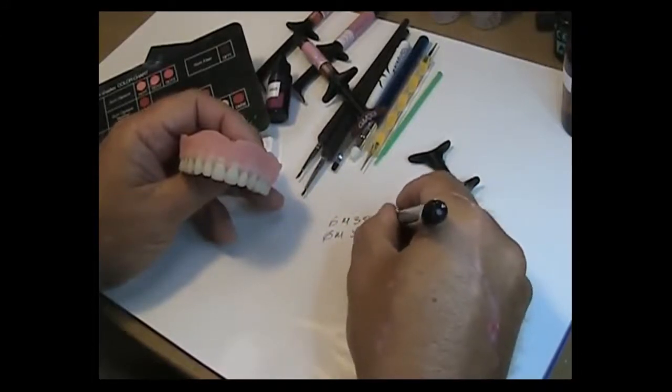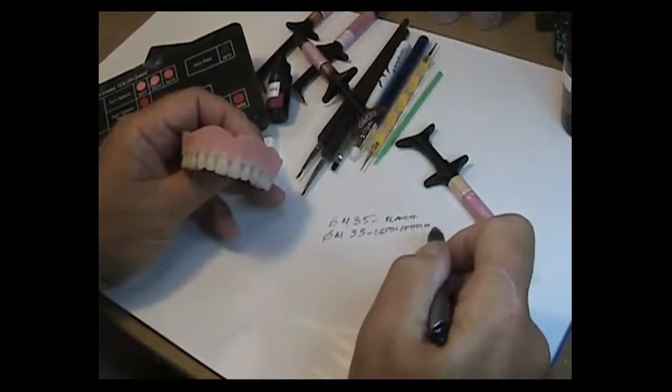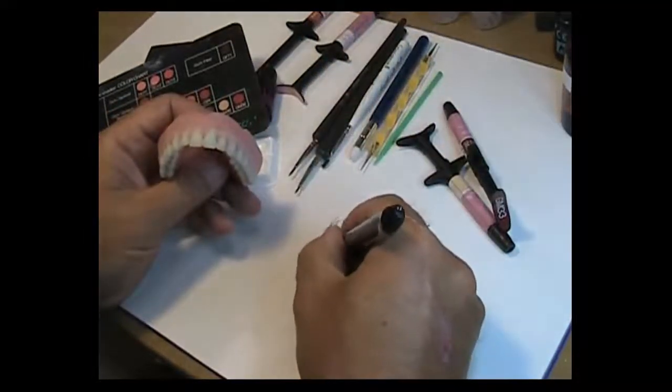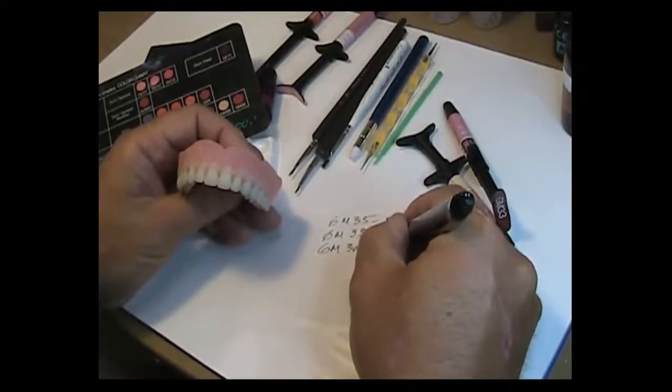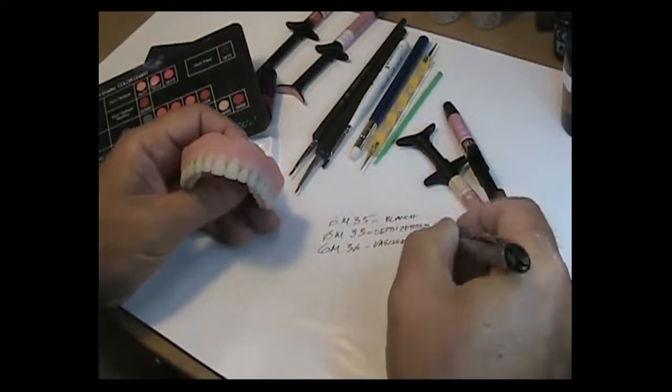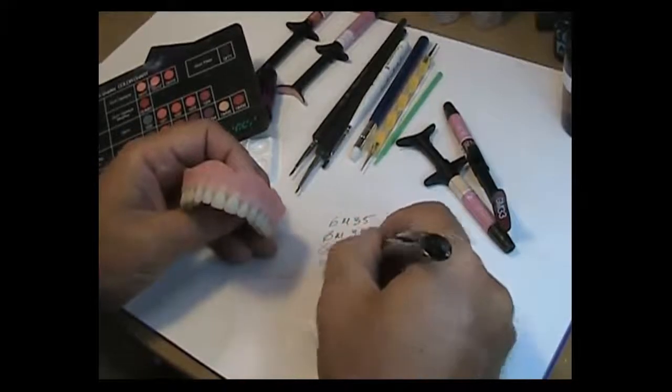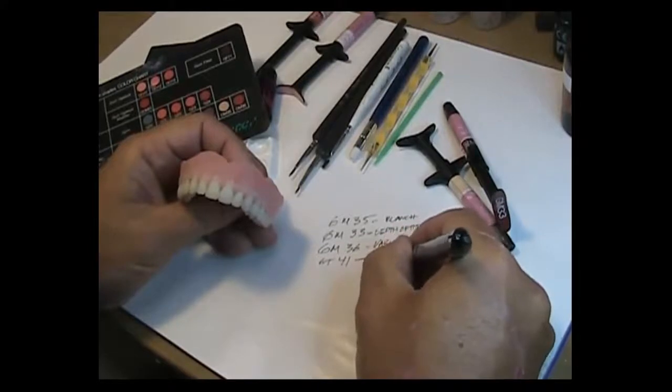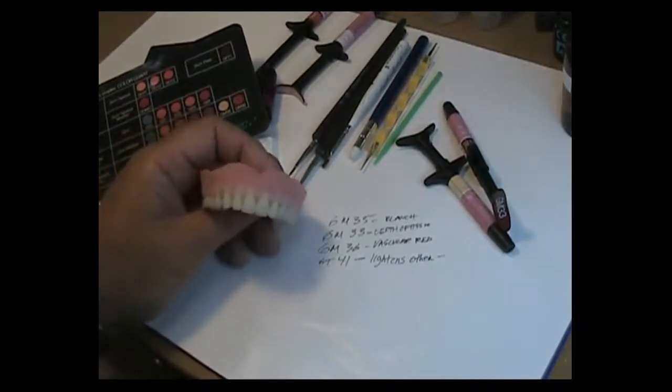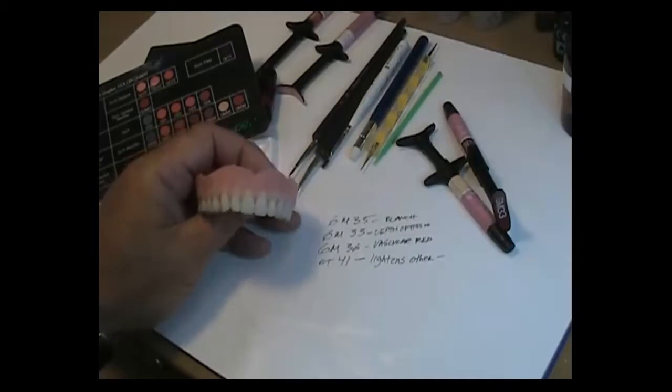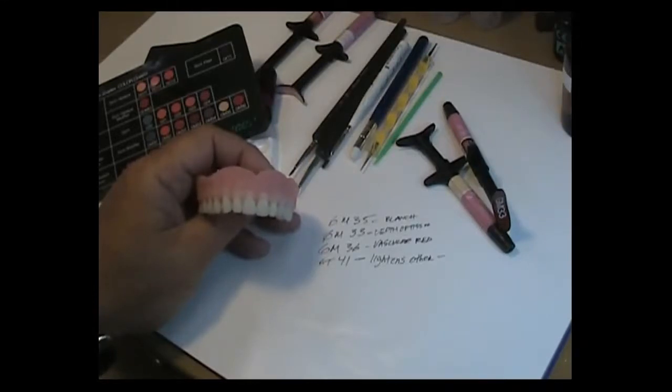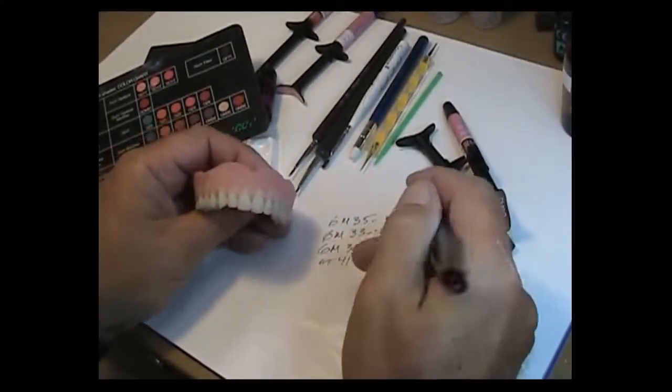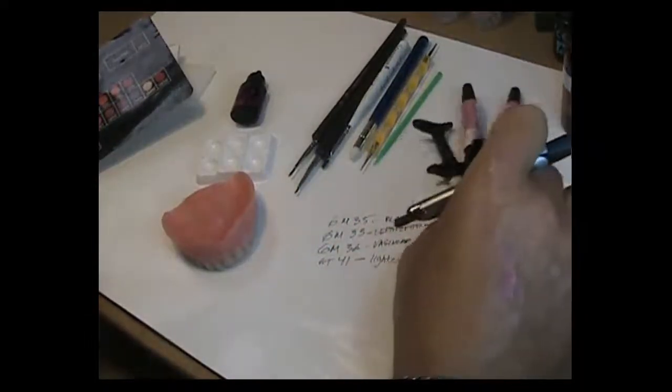So you have 35 for the blanche, you have 33 which gives you depth of tissue. Then you have 36, GM 36, which is your vascular red. And you can make that more or less intense by adding or subtracting the GT 41 which will lighten up every color you have. You have to mix it in ratios. If you come to my hands-on course at the GC America's Learning Center in August, I'll be demonstrating how I use those different variations and how I use the gum translucent in order to obtain the effects that I'm looking for. Anyways, GM 35, 33, 36, and GT 41. Okay, so really we're talking about four syringes here.